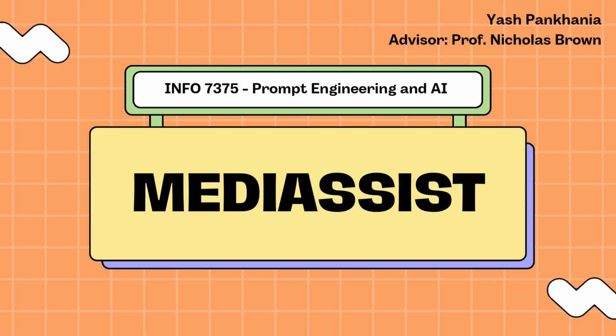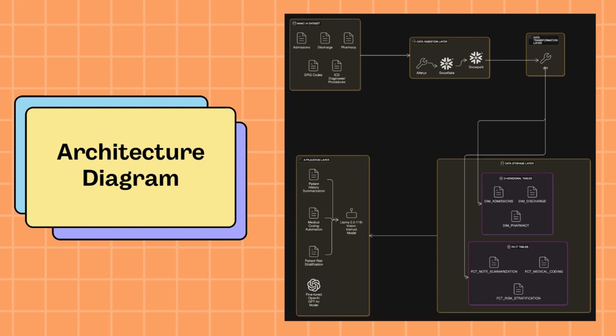And finally, retrieval-augmented generation module. This offers precise and context-aware answers for complex clinical queries. The chatbot bridges the gap between raw clinical data and actionable insights, optimizing clinical workflows.